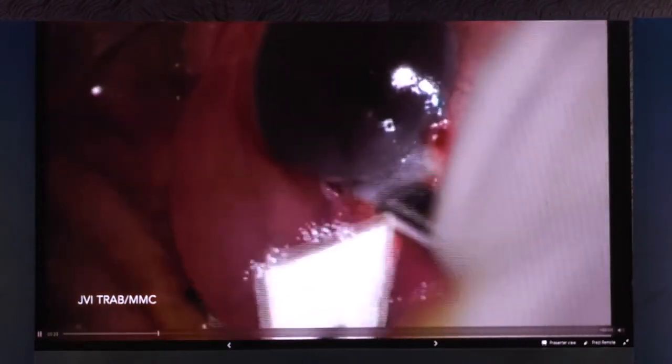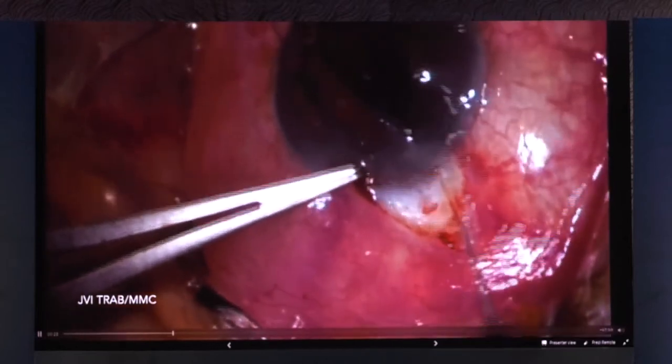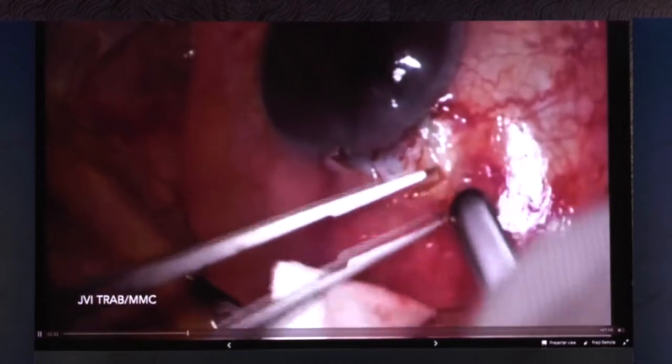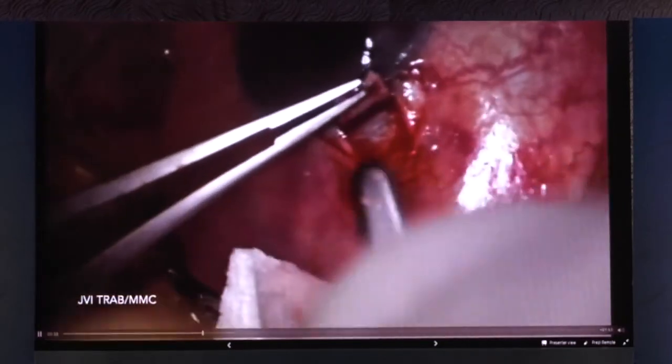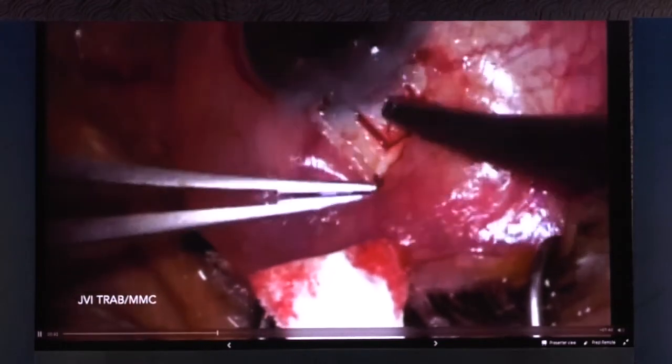And I do judicious diathermy. You do a trapezoidal flap. There's no one flap that's noted to be the best in literature. Triangular, trapezoidal, circular, be my guest. Do what works in your hands. I like trapezoidal because that's what I trained with, and I'm able to better control my postoperative outcomes with this. But really, it's your choice.